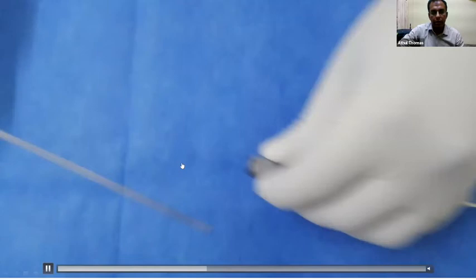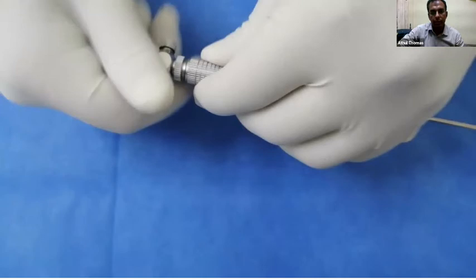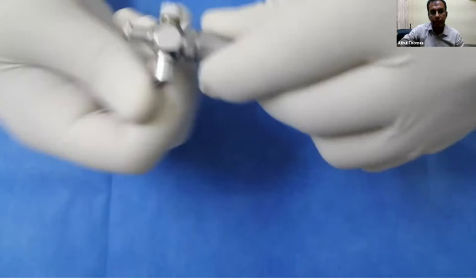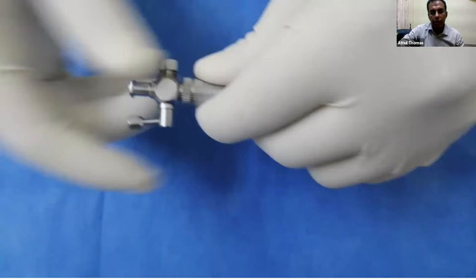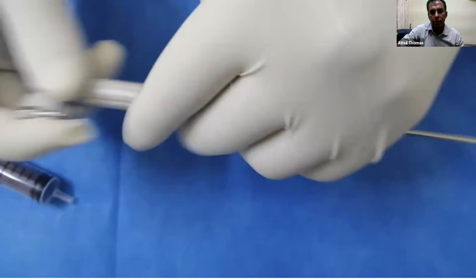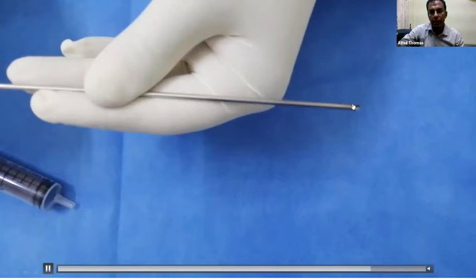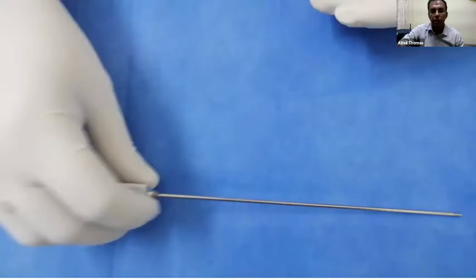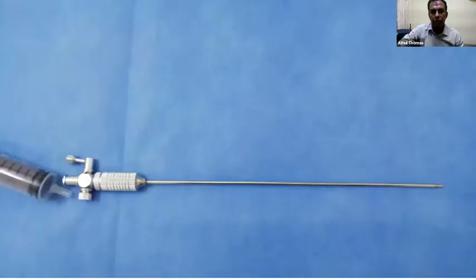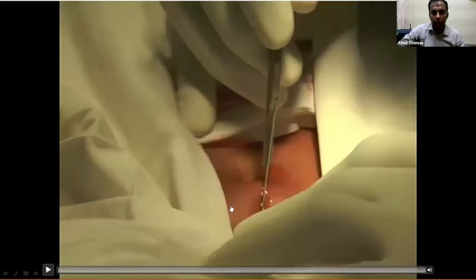Before the procedure, ensure the stylet assembly is tightened properly. The stopcock should be positioned perpendicular and then straight. You must verify the spring action is intact and flush the needle to confirm patency, since it is a reusable device. When pressure is applied it becomes sharp, cuts through tissues and enters the peritoneal cavity — once inside it returns to blunt and will not injure the bowel.